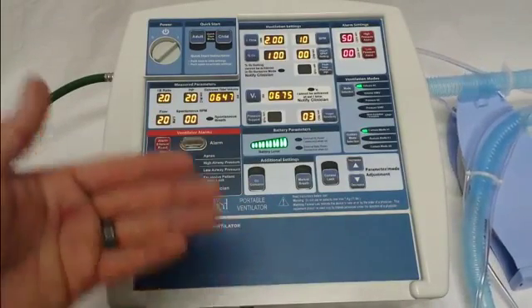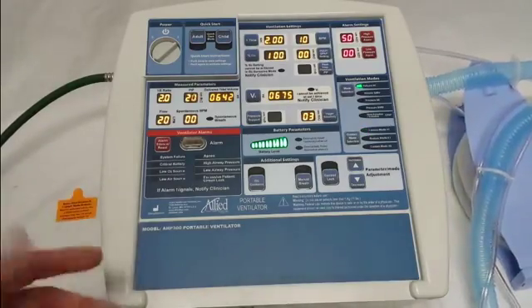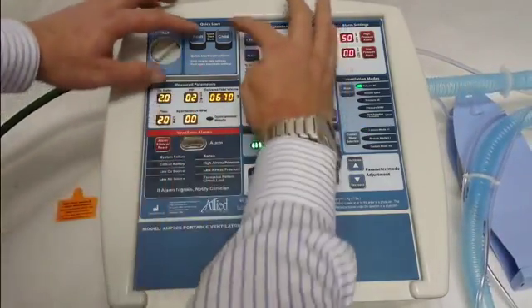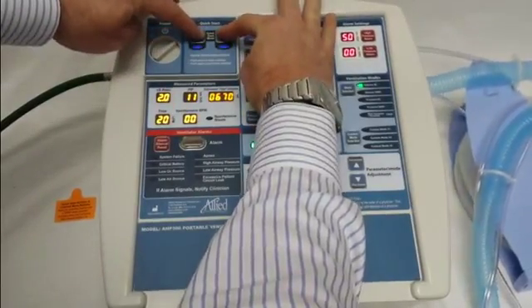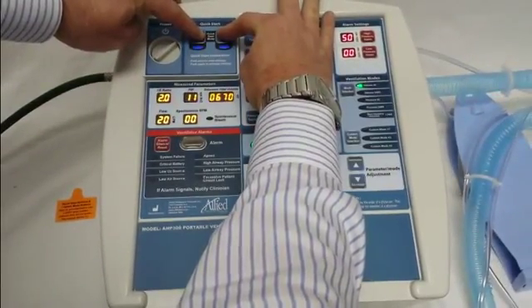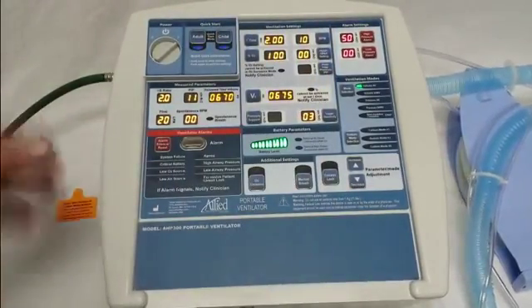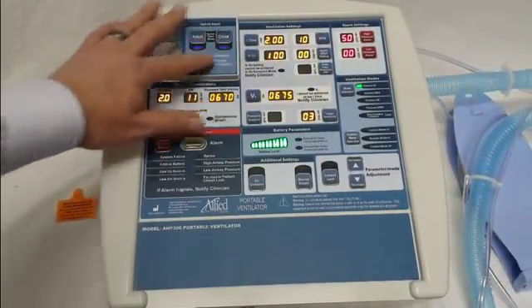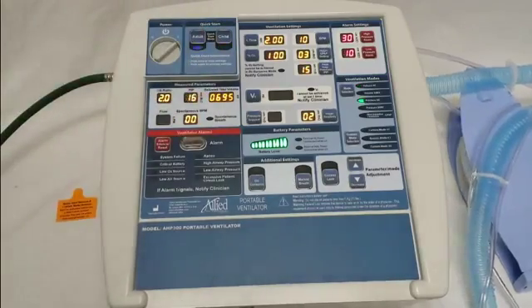That's because they need to be either confirmed or programmed to whatever settings you'd like to use. To enter the programming, we're going to start with the quick start mode. You simply press and hold the adult and child quick start buttons at the same time. You'll notice a double beep, then you can let go, and then you'll press whichever mode you'd like to program first — let's do the adult.